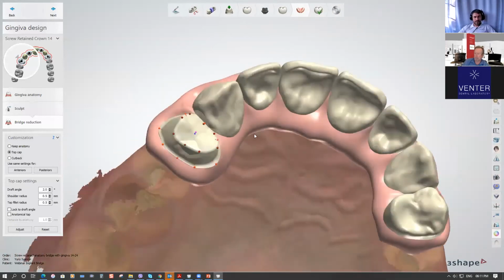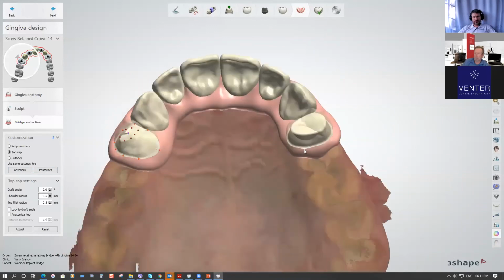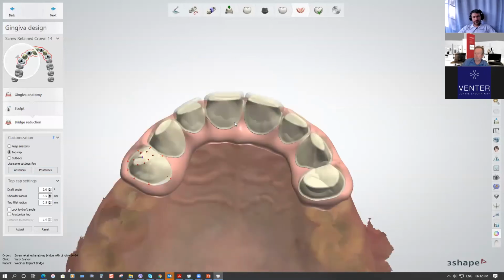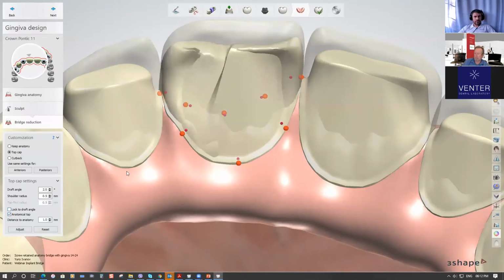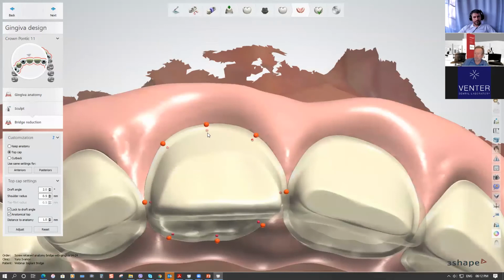And also we could apply the same settings for all our posterior or anterior teeth, just clicking on the posteriors, and you could see the opposite tooth has the same top cap, and anteriors, just click on. Now we have kind of the dies all around. Click on the tools to modify it, and here we can make any modification. This way, we could lock the draft angle and keep the anatomical top, for example, and adjust it. Or let's reset it, and we could make any changes here if we wanted to.